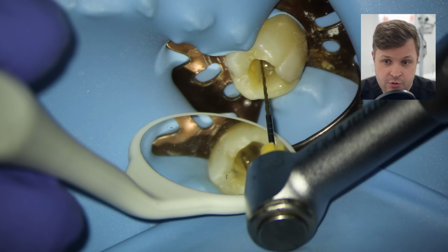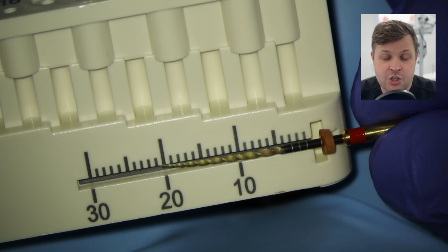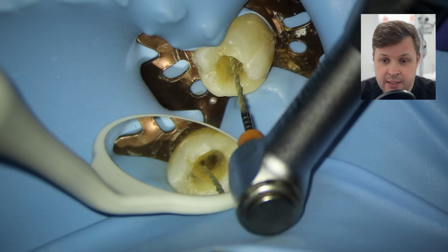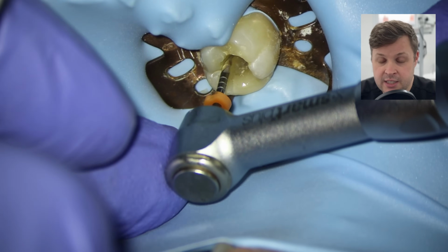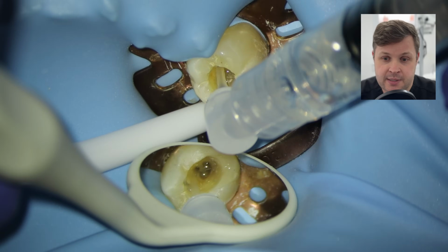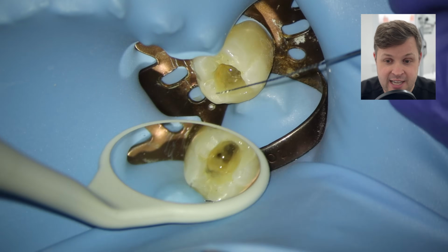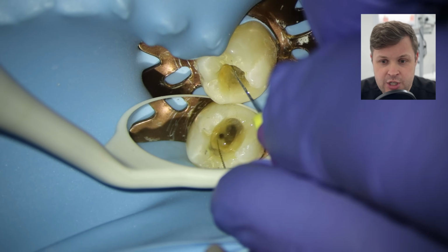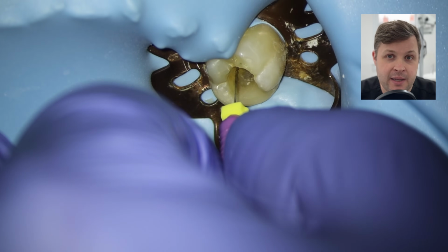We're going to make sure that's all cleaned out, and then I'm going to use my master apical file just to coronally shape this mesiolingual canal. I'm not going to go too far with this because I don't want to ledge the canal, it just opens it up. Usually you can then negotiate down even further. I've got a size 10K file with a little bend at the end, and as I gently push this hand file to length, it is now getting a bit further.